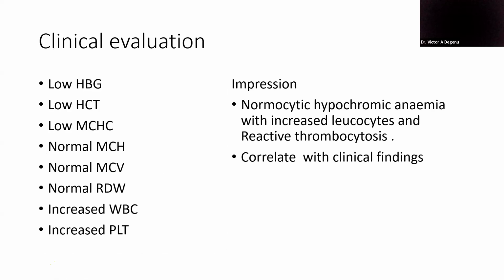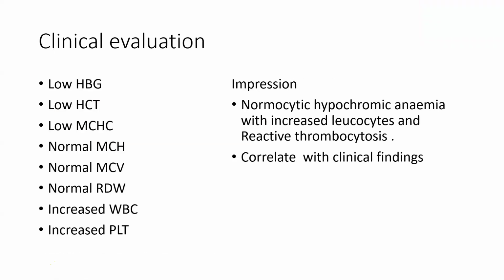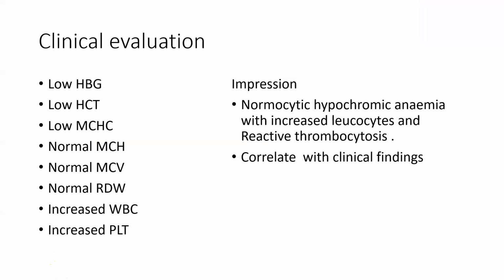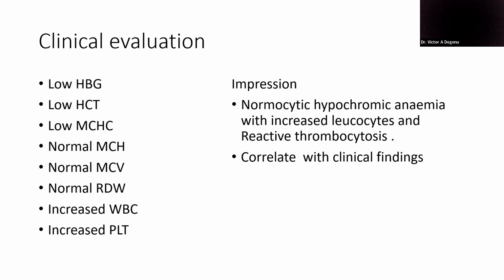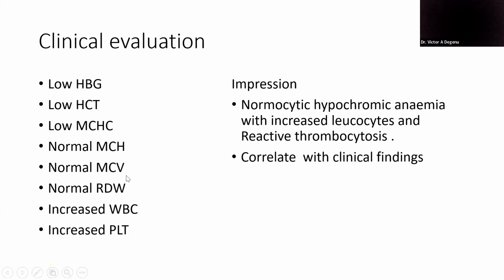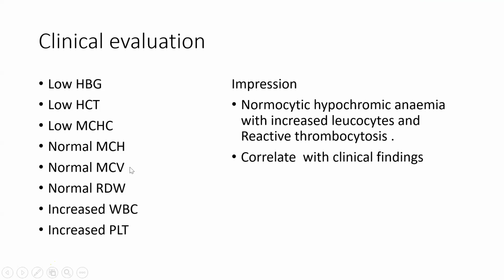Okay, and then with the early iron deficiency as well, MCV being normal, and MCH being normal, how do you reconcile that with early iron deficiency? In early iron deficiency, you may have normal MCV. I think Mr. Alote has just explained that with overt and covert iron deficiency. So in early iron deficiency, you may have this parameter to be normal or slightly, mildly reduced.